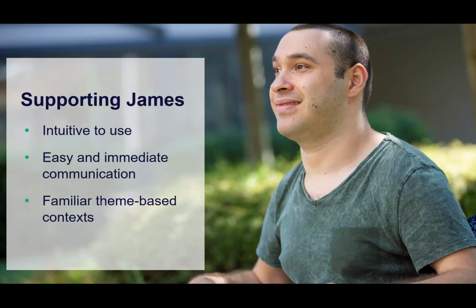And so his staff started thinking and they thought, you know, let's explore TD Snap Express because they felt it would be a great solution to try. It's intuitive to use and it's a simple starting point for everyone. It also would allow James to communicate immediately and easily in theme-based contexts with which he is familiar.